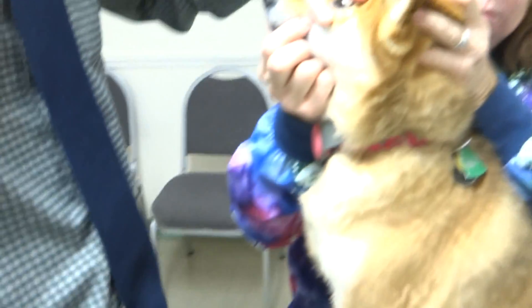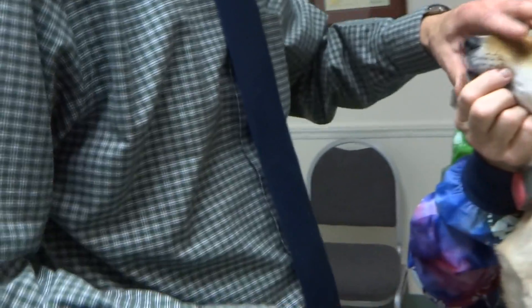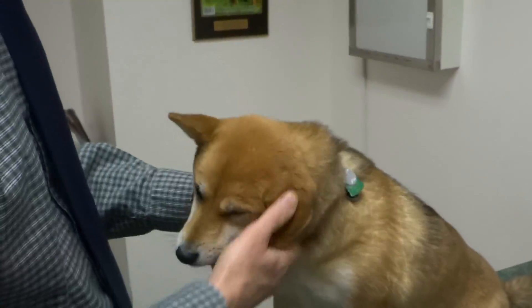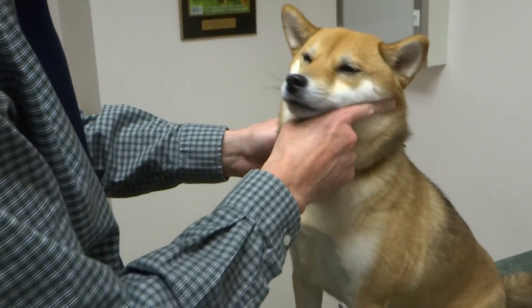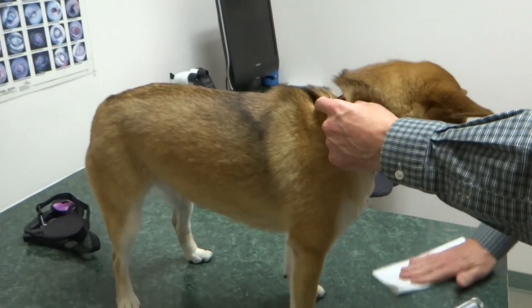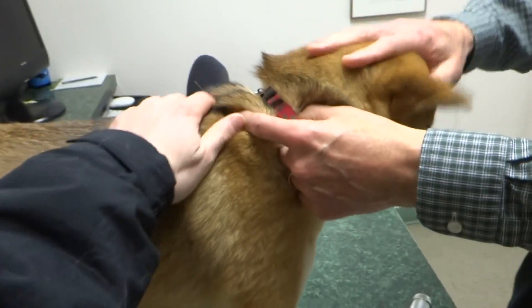Okay, let's take it out on that side. There you go — what do you think? Stay here now, the other side — I got you. You're a good girl. All right, sweetie pie. That was weird, wasn't it? That was very weird. Good girl.